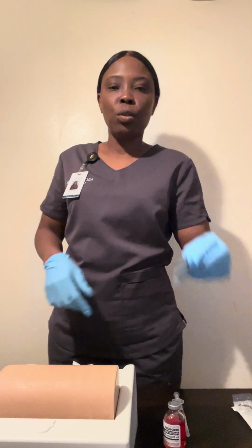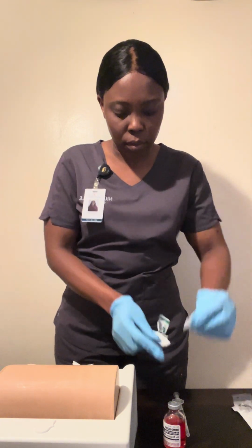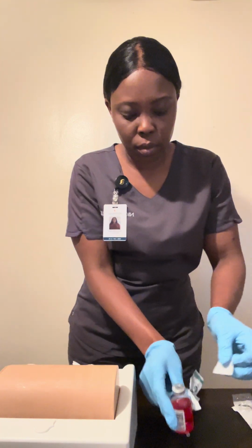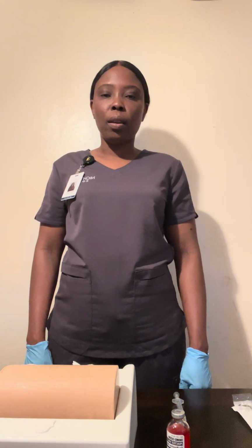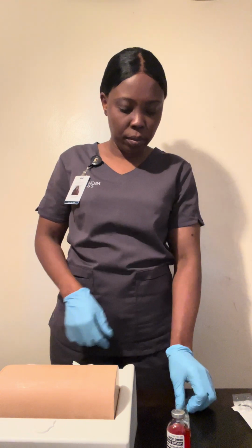Okay, now I'm gonna use an alcohol prep to clean the top of the vial. And then now I'm gonna withdraw 1.5 ml of air, and then I will inject that into the vial.